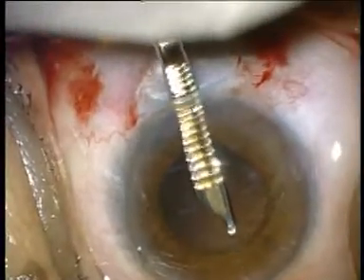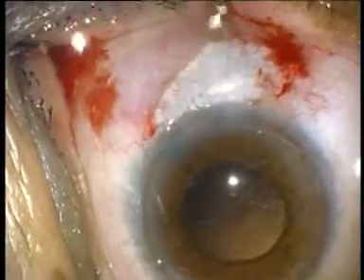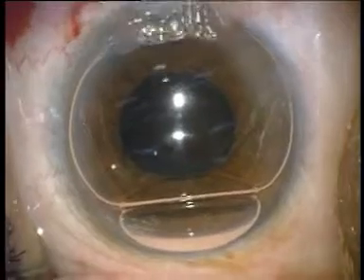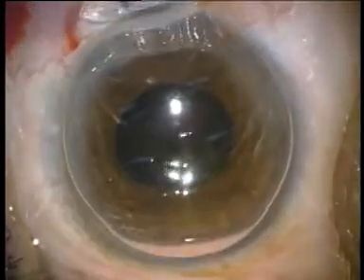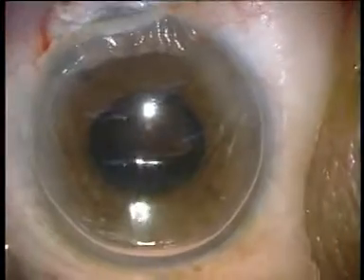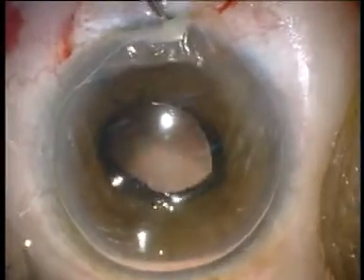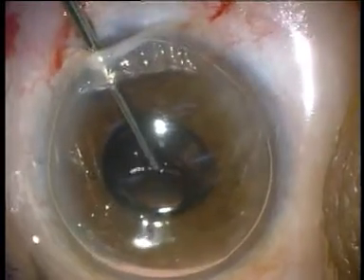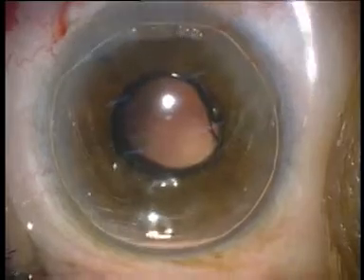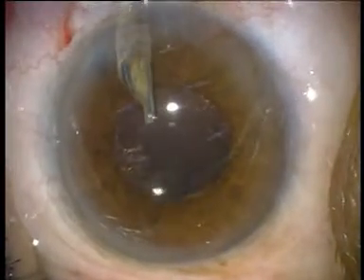Debris is then removed using the Simcoe cannula, and an air bubble or viscoelastic is instilled into the anterior chamber. As the posterior chamber intraocular lens is inserted, the leading haptic folds the cornea inward, trapping air within the anterior chamber, and is then directed behind the capsular flap into the capsular bag. The trailing haptic is placed behind the capsular edge superiorly with a combination of intraocular lens rotation and gentle posterior pressure. Fine positioning of the intraocular lens is achieved with the Simcoe cannula.